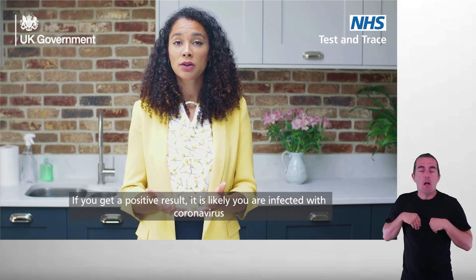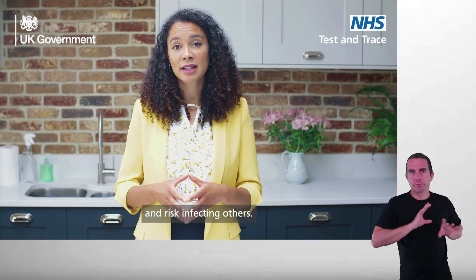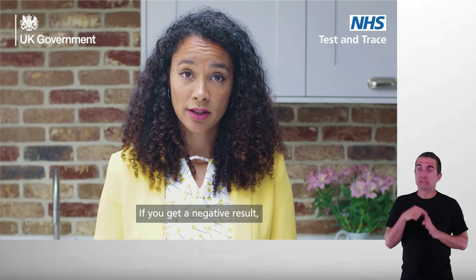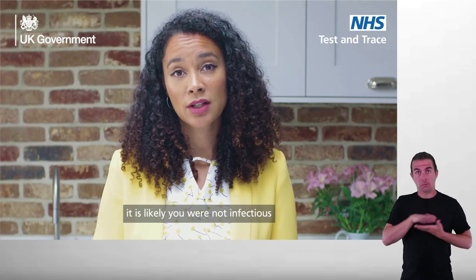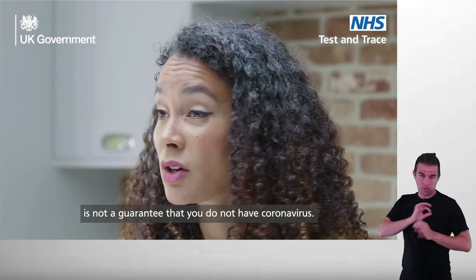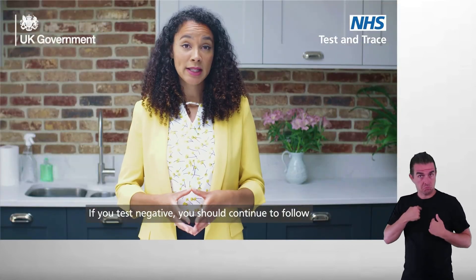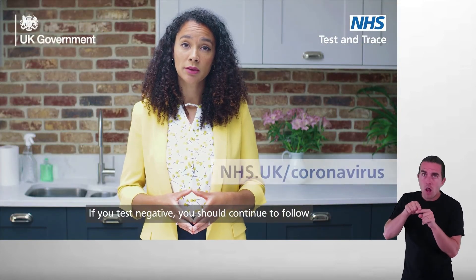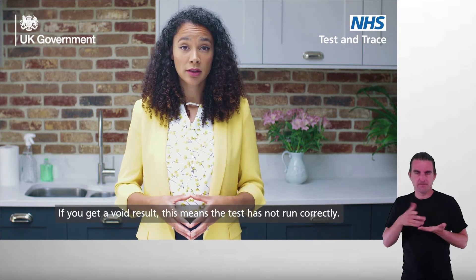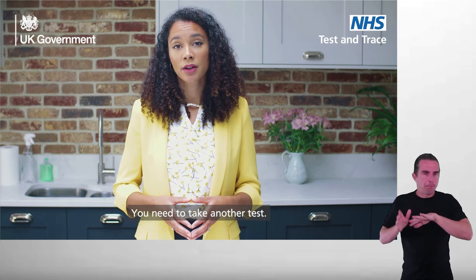If you get a positive result, it is likely you are infected with coronavirus and risk infecting others. If you get a negative result, it is likely you were not infectious at the time the test was taken. A negative test result, however, is not a guarantee that you do not have coronavirus. If you test negative, you should continue to follow national and local rules and guidelines. If you get a void result, this means that the test has not run correctly and you need to take another test.